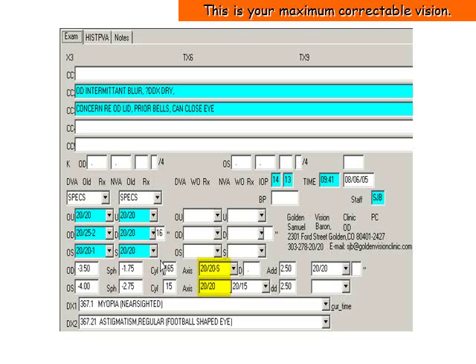Here you see a chart that has highlighted in yellow a maximum correctable vision. You can see how well you can see and the changes from your prescription over time with the push of a button.